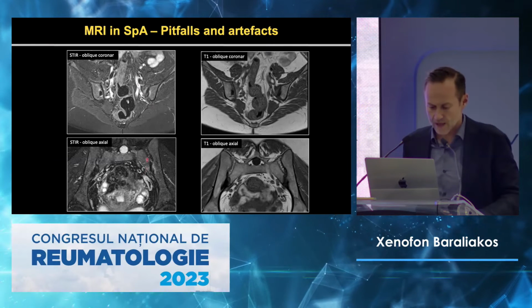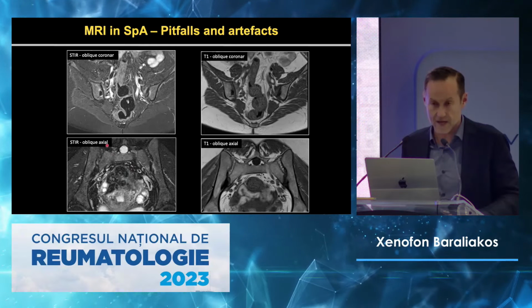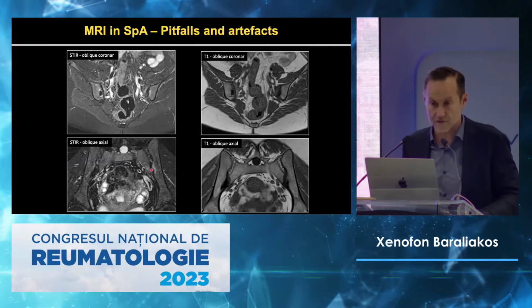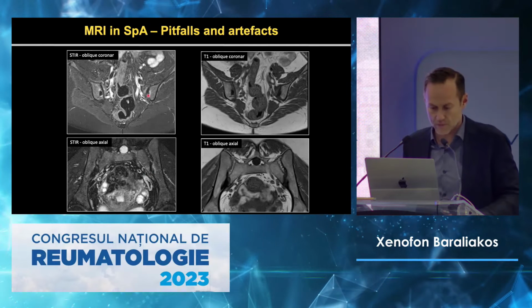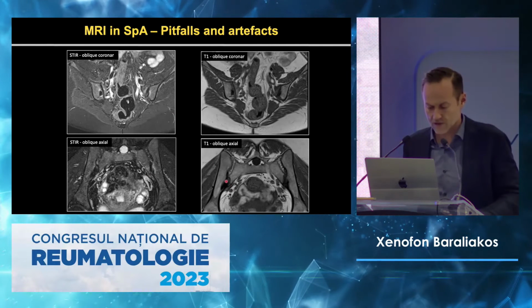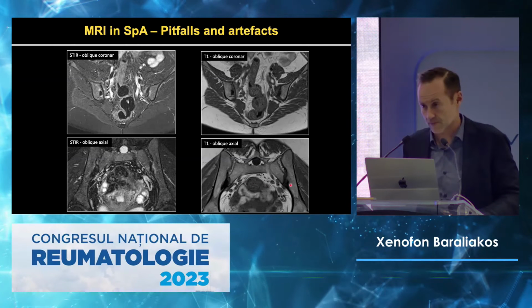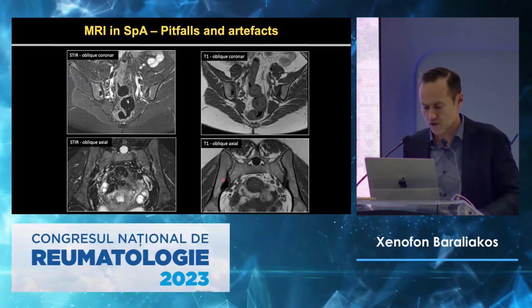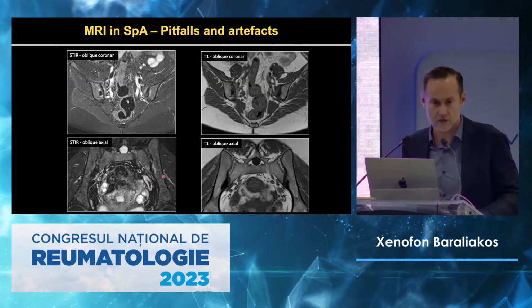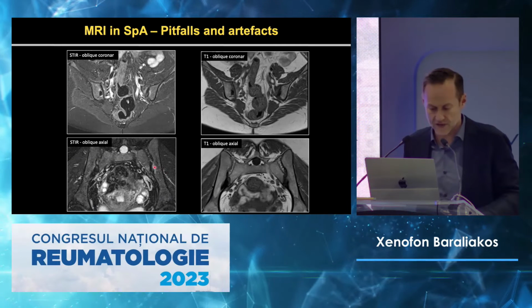Here you see you are in the very front, because that's the bowel, that's the semi-axial image, and you see the edema is here in the very front and in the lower part of the joint. There is only sclerosis. You remember this is white on the X-ray. Triangular form, that's a typical picture of a female patient with osteitis condensans, even if there is edema.